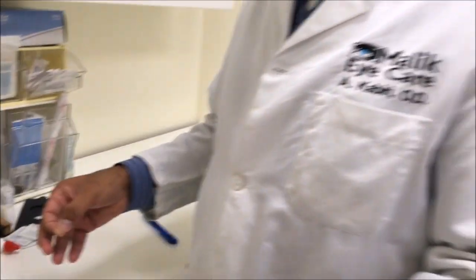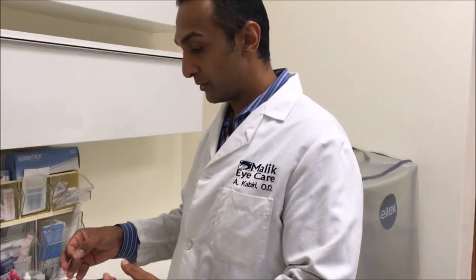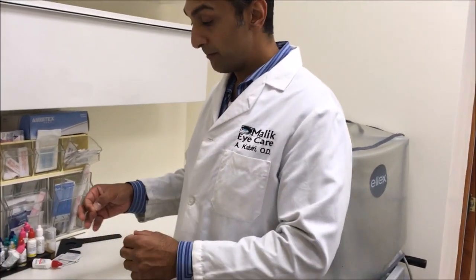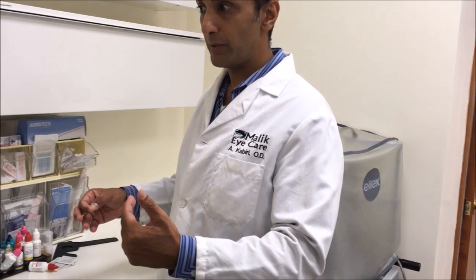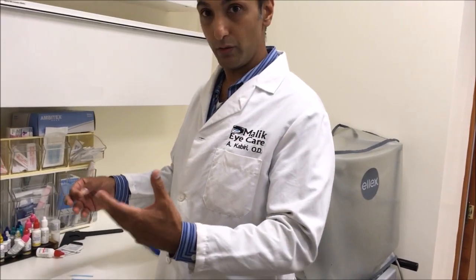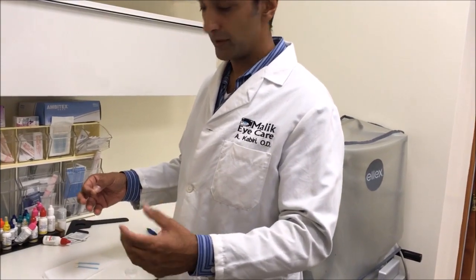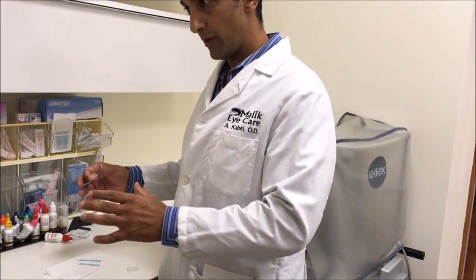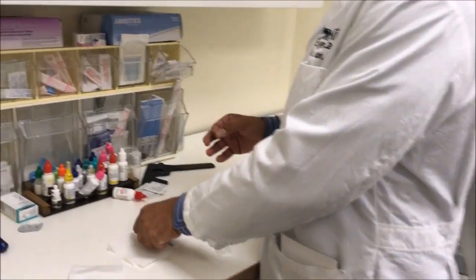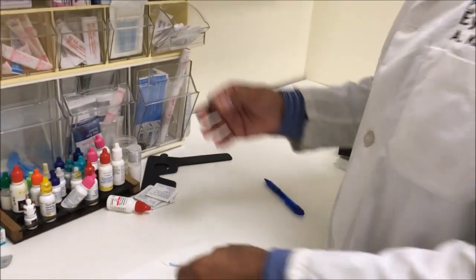For those of you who do this already in practice, you might think you need forceps, you need a speculum, you need a number of things that aren't shown here. Sometimes when you go near people with forceps and a speculum they get spooked and you'll never get their full cooperation to complete the procedure properly. So without using forceps and a speculum, we have in place a Wex cell sponge and fingertips.